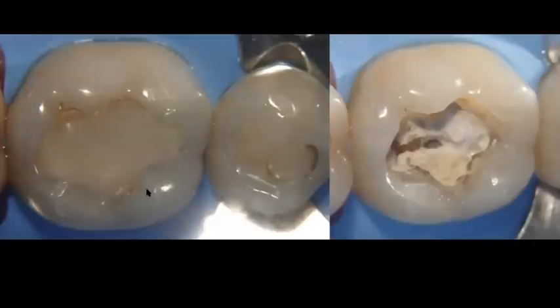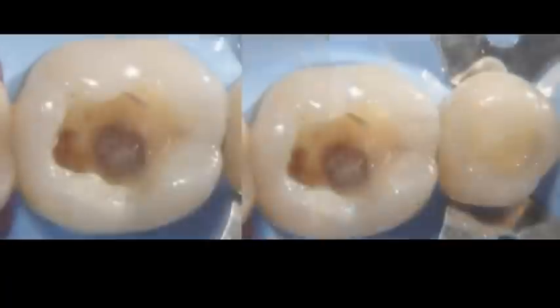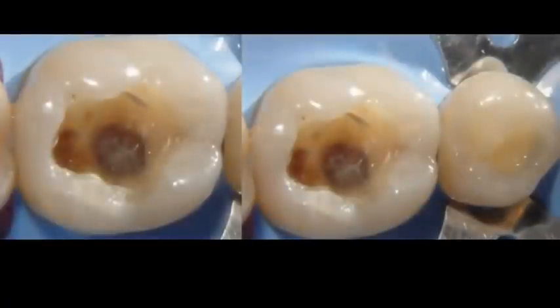And this is typically the case in a short period of time. When you do a build-up technique like the ones that we're sharing with you, you will notice that your composite restorations will last longer, if the occlusion is adjusted well and you've looked at the occlusal analysis, because anatomically they're better structured. So here we go. We remove.